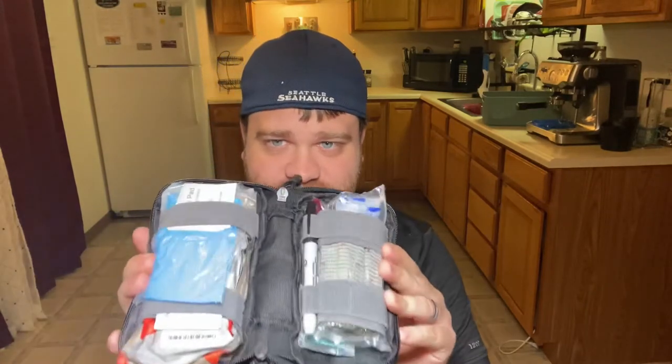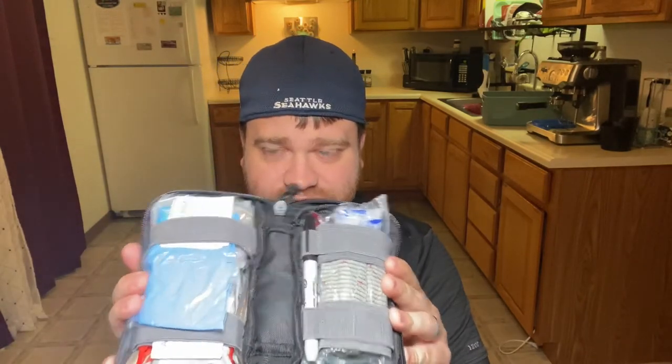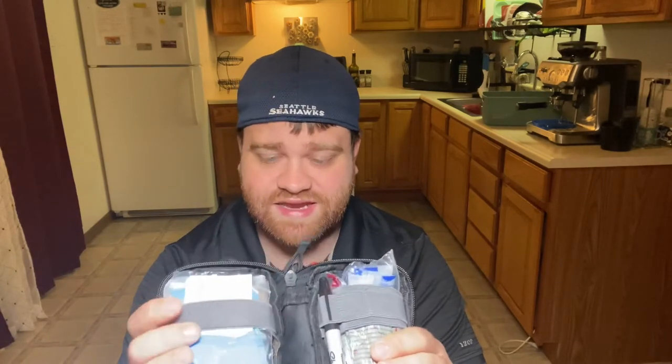I was able to get everything in here neatly, plus add a couple things like nitrile gloves, which brings me to my next point. If there were a couple things I would add to this kit to feel really good about it, I would add a decompression needle and nitrile gloves. And that would be an excellent place to start, just for a basic kit getting started out. Carrying this, I know that there are not many trauma-related injuries that I am ill-prepared to handle.